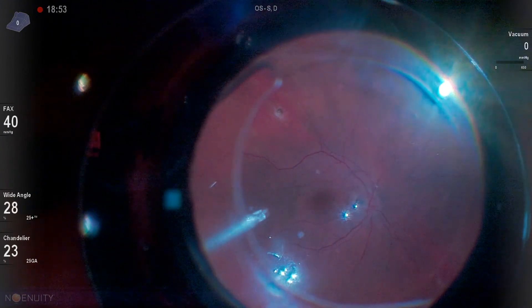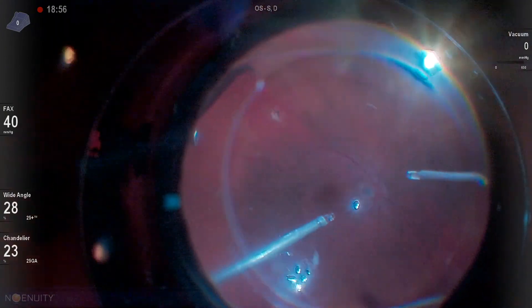I dry, dry, dry as much as I can. Despite that, there's still fluid that percolates up through that pit.